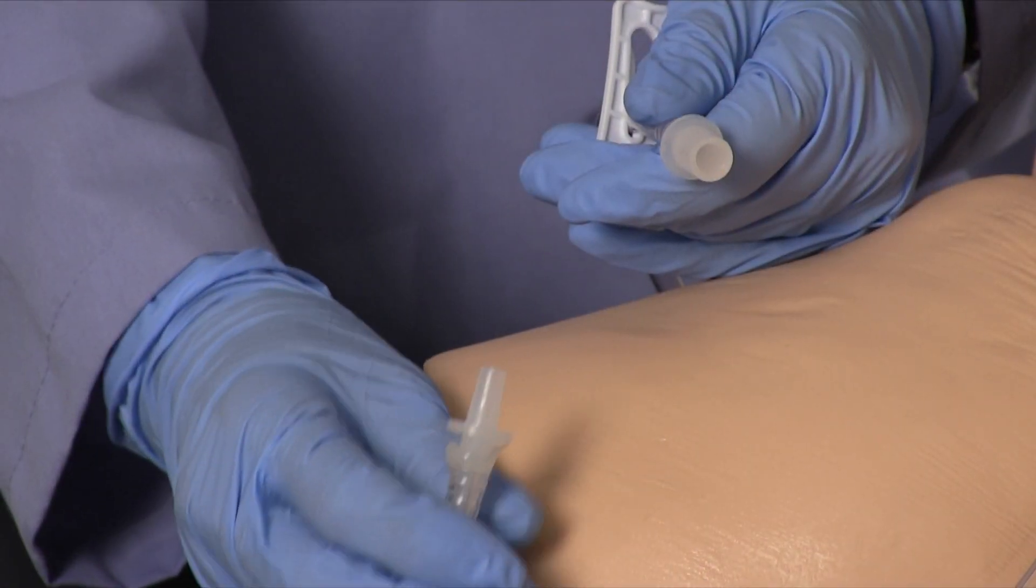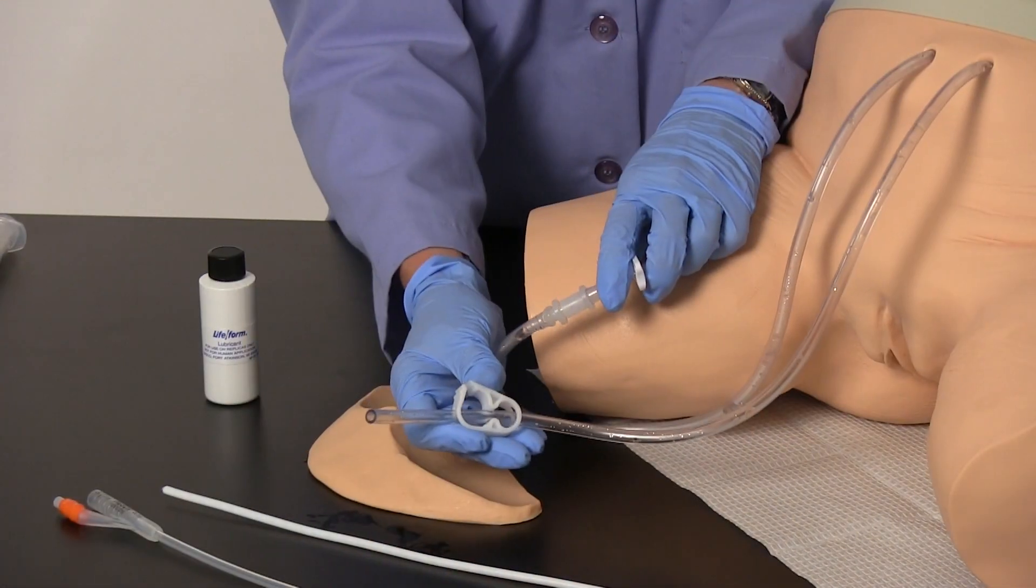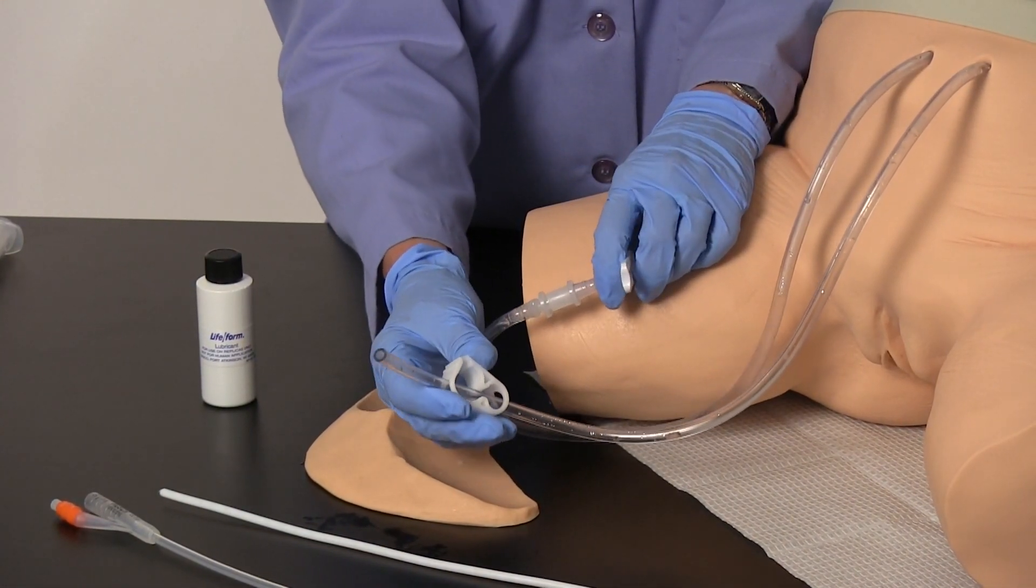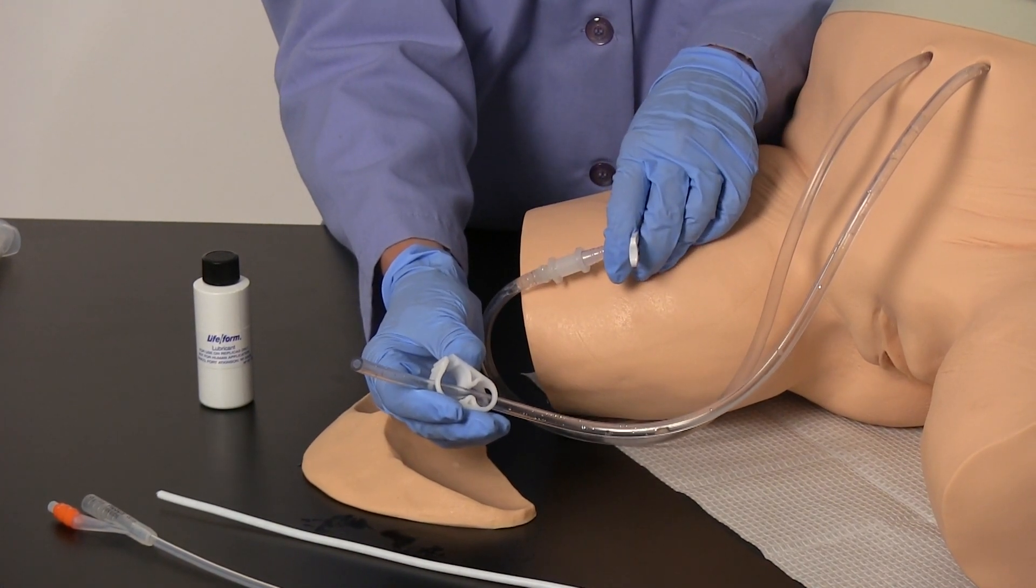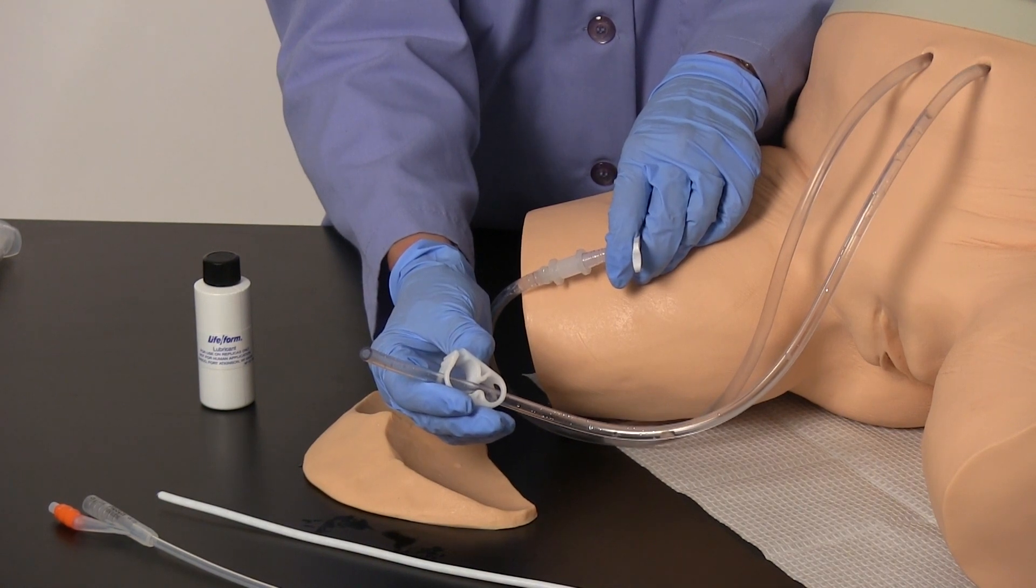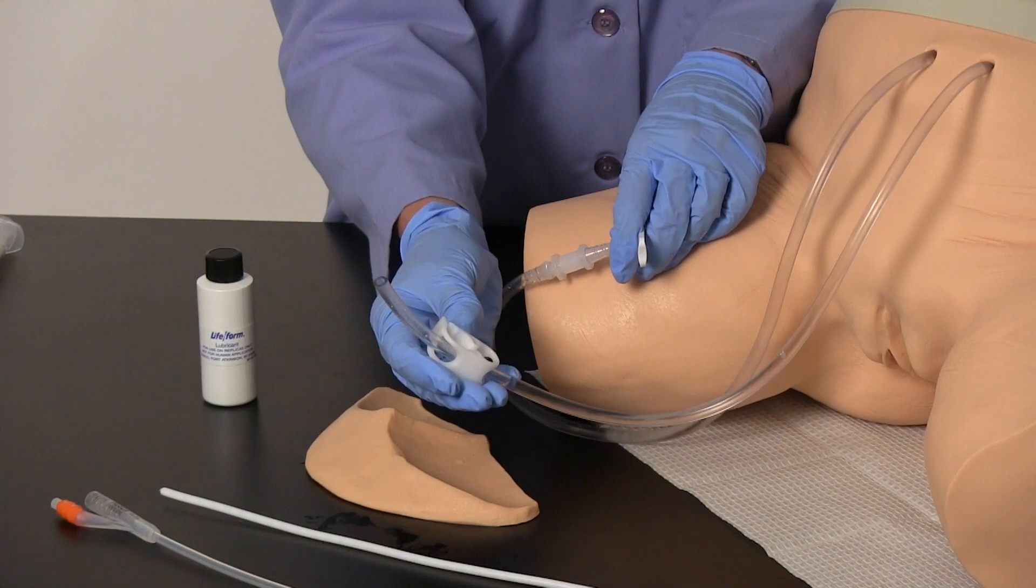Using the quick disconnect fitting, connect the fluid administration set to the simulator. To fill the simulated bladder inside, open both the slide clamp and the pinch clamp allowing water to flow through, charging the system, and then close the pinch clamp on the drain tube. Your simulator is now ready to perform catheterization procedures.